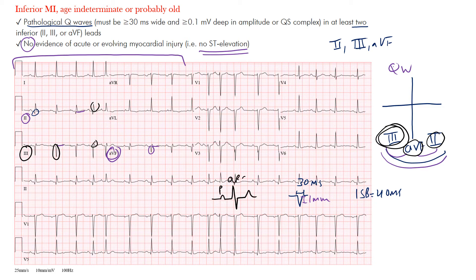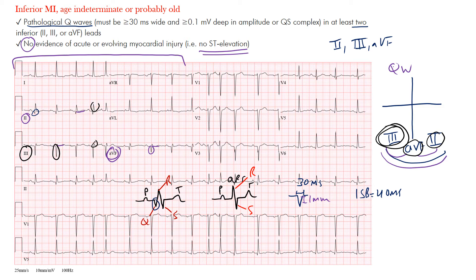This is your QRS complex and T wave. This is an R wave. This one here is an R wave — this is not a Q wave, this is an S wave. While it's deep, that was something I initially struggled with when learning EKGs — misclassifying S and Q waves. So: here's your P wave, this is a Q wave, this is an R wave, this is an S wave, and here's your T wave.